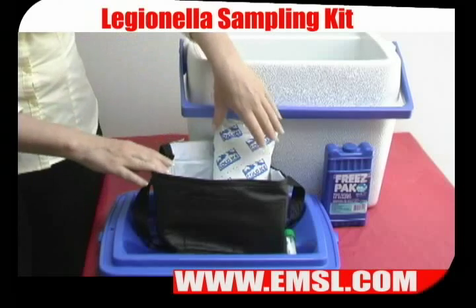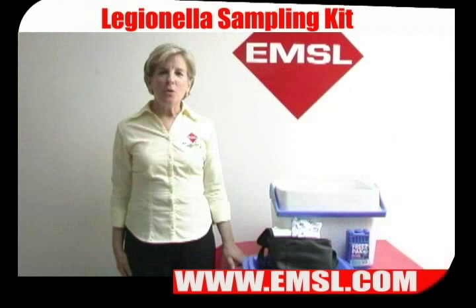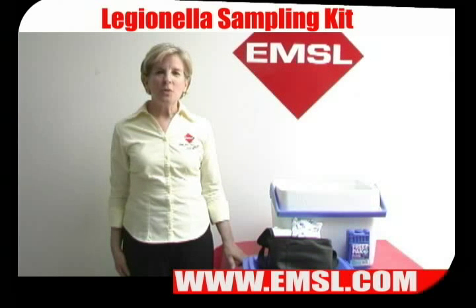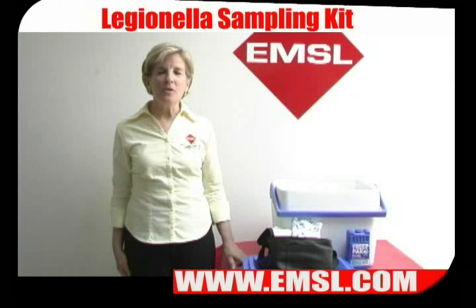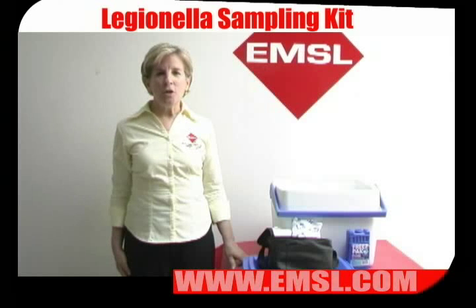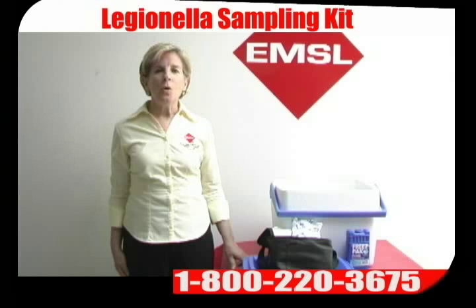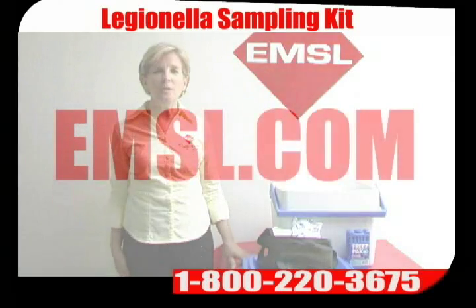Seal them up and ship the samples priority overnight to the laboratory. If you requested cultural analysis, you will receive your results within 10–14 days by email, fax, or standard mail. If you chose the PCR test, you will receive your results within 2–5 days. If you need more information, please call EMSL at 800-220-3675, or visit our Legionella website at www.legionellatesting.com, or visit the EMSL website at www.emsl.com.